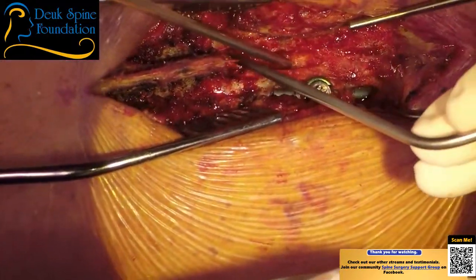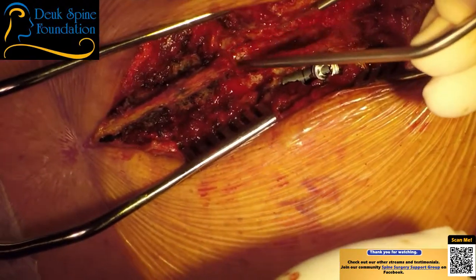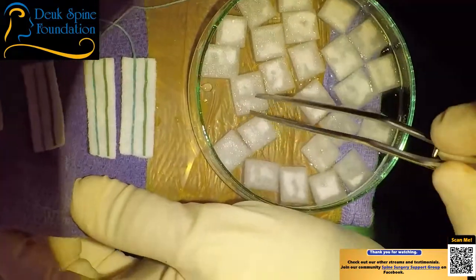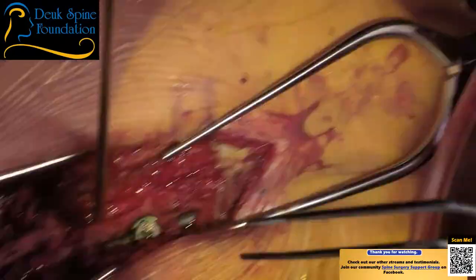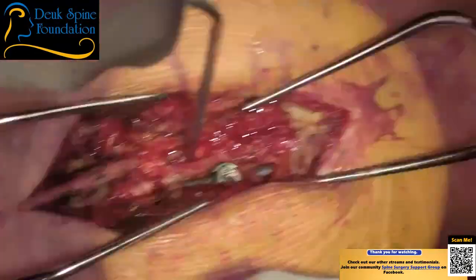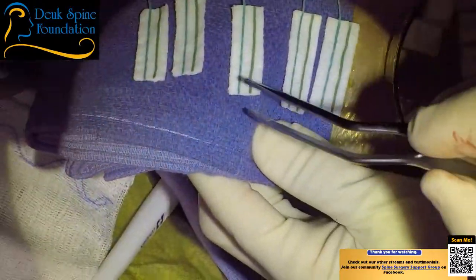Let me have gel foam. We're not using any plates and screws today. These are old ones. We're not putting new screws or plates in. We're not instrumenting this case. So, we're just doing a decompression. We're just taking the pressure off the spinal cord. We won't be doing any fusion, okay? So I just want you all to know that.